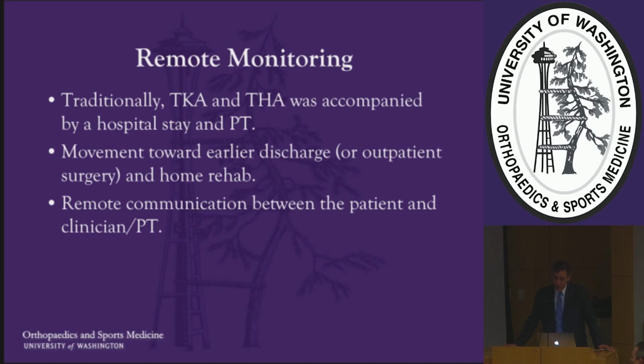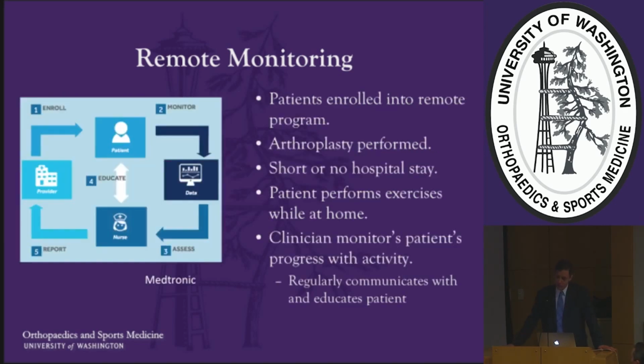But with improved technology and improved procedures, there's been a movement towards shorter hospitalizations and in some cases even essentially an outpatient surgery, which has spurred this research in developing ways to monitor patients while they're doing their therapy at home. So what this is, is a remote monitoring program. Patients are enrolled and undergo the surgeon's total knee or total hip arthroplasty of choice, and then the patient undergoes a short or sometimes even no hospital stay before going home and performing a self-guided home rehabilitation exercise program.